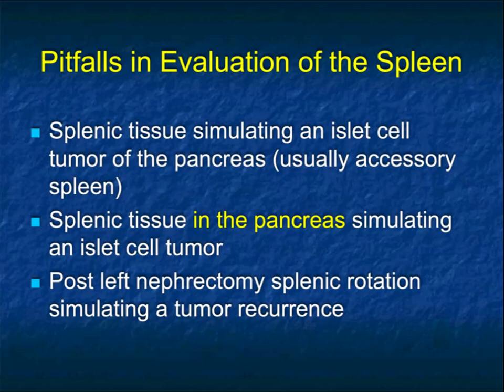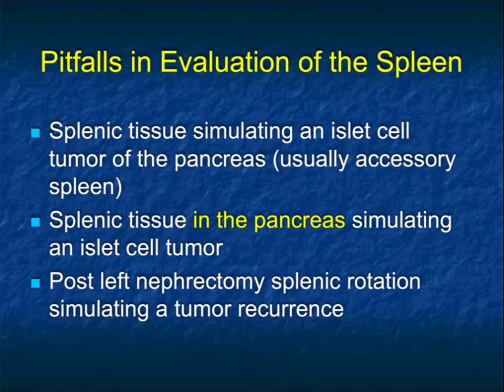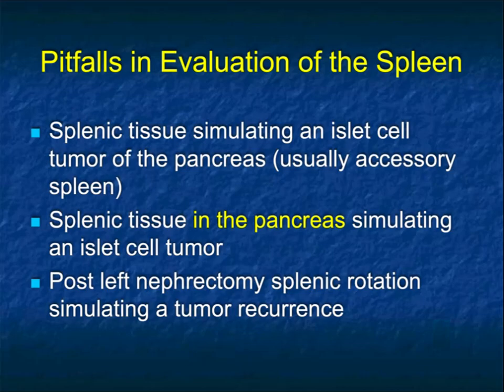One key pitfall is that splenules near the tail of the pancreas — sometimes intrapancreatic — can be confused with neuroendocrine tumors, particularly on arterial phase imaging. Rotation of the spleen in patients with left nephrectomy can simulate recurrence in the left renal bed, though recognizing the spleen for what it is should prevent this error. Splenic lesions in general are challenging; the majority of incidental lesions are benign, but we do see lymphoma, metastatic melanoma, hematomas, and hemangiomas.